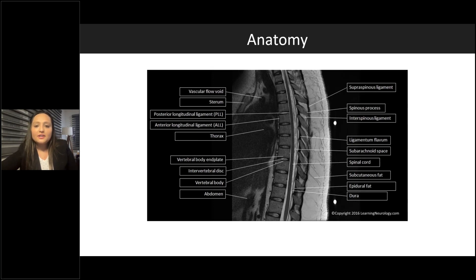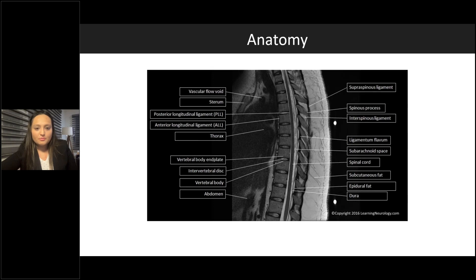A systematic approach to a normal thoracic and lumbar spine T2-weighted image: we confirm T2 by the white in the intervertebral discs. Moving systematically, we see the spinal cord is gray, followed by CSF fluid, epidural fat, and the posterior elements. Some degree of kyphosis may be visible. These are straightforward normal findings that all fellows should recognize as a baseline before identifying pathology.